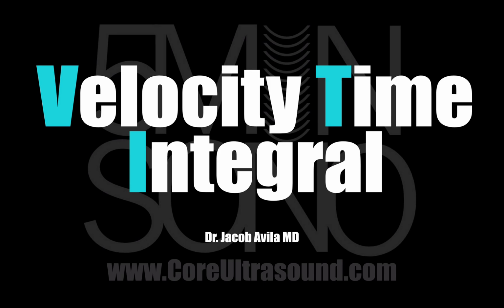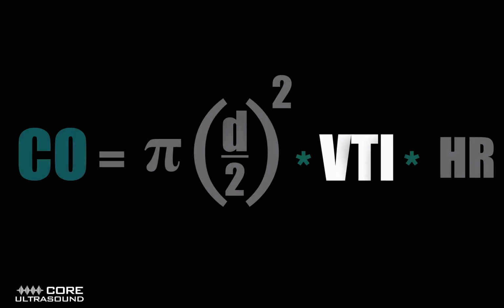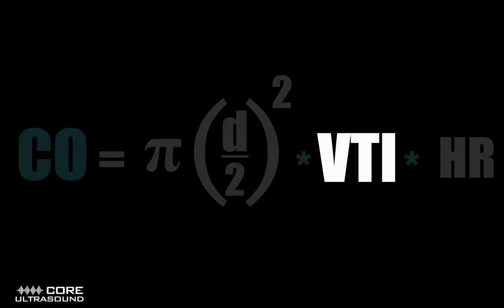In this video, we are going to discuss how to calculate the velocity time integral when you are looking at the heart. Now, the VTI is a component that you need to calculate the overall cardiac output in a patient. Most of the time, however, the point of care provider is not really trying to figure out exactly what the cardiac output is. Rather, they're trying to just figure out what the VTI is.